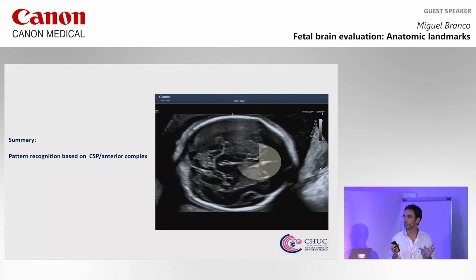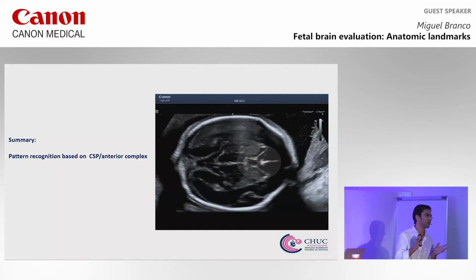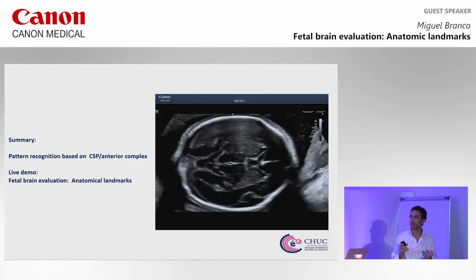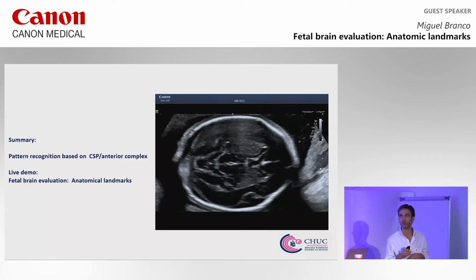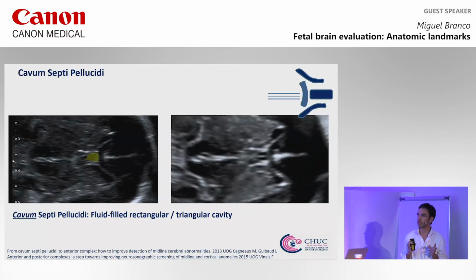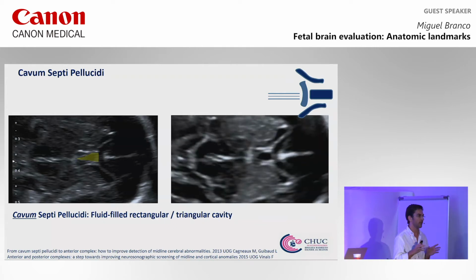On the first half, we are dealing with pattern recognition on the anterior complex, and then we'll have a live demo where we try to explore anatomical landmarks on fetal brain evaluation. We'll start with some basic anatomy.